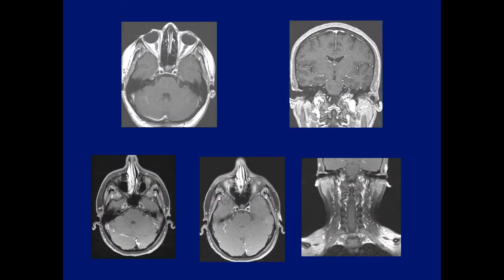The problem with this case was that for the two studies that were missed, the history said the patient had tingling and numbness of the cheek and upper lip. So that should have led people to look in the trigeminal region, but no mention was made of the abnormalities.